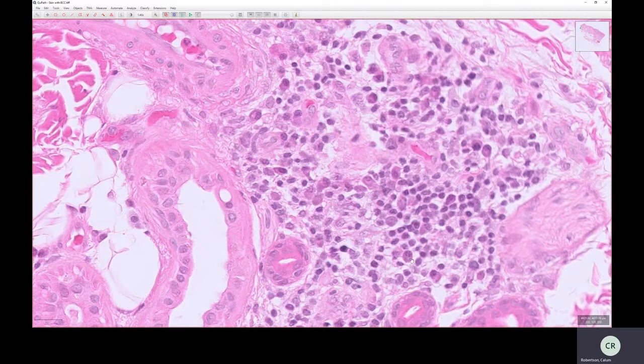And right next to the nucleus, there's a more intensely pink bit. It's not just in this cell. This one has it as well, an intensely pink bit just right beside the nucleus. Here's another example. You've got the nucleus here, an intensely pink bit within the cytoplasm, then a bit more cytoplasm round about it. And that intense pink staining is staining up the Golgi apparatus of this cell. It's so-called a perinuclear hof.